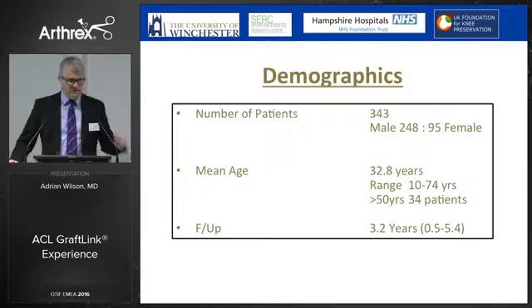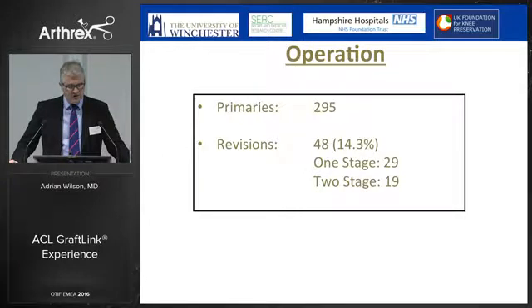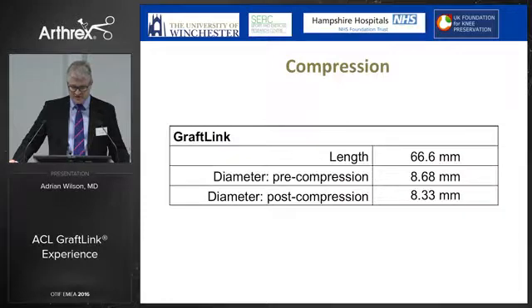So we've been following the cases, and in this series now we have, in my NHS series, 343 cases. The mean age is 33, and the follow-up is out to 5 years for some of these cases. Primary is 295. We get a lot of tertiary referral cases from other centres, so we do a lot of revisions, mostly as one stage, but often as a two-stage.